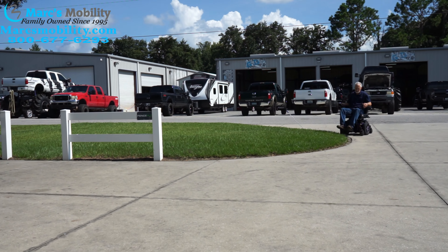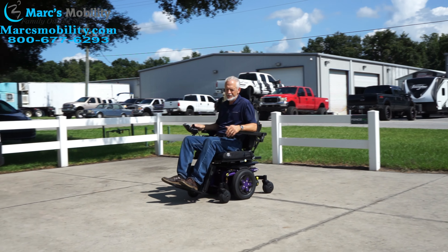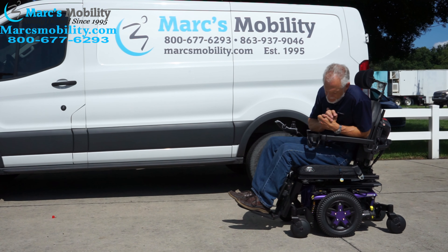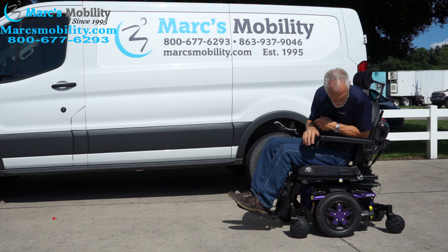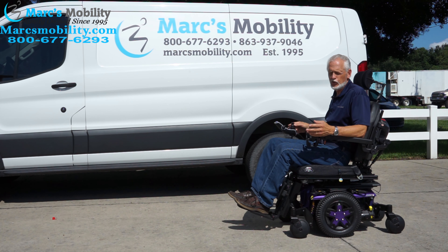These have no problem in my grass at all. These have a really good suspension, especially in the grass — you can feel it going through the grass really well. So this is the Quantum Edge 3 with the electric tilt, electric legs, electric back — three electrical functions. It has the drain cup holder, it has the lights, just a really nice power chair with about two miles.